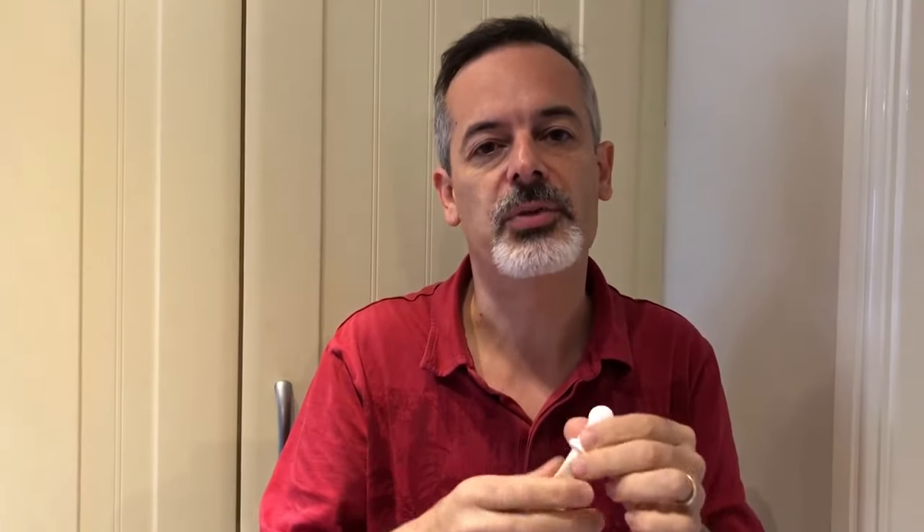Now that can be a bit difficult to do in some people, so you may want to blow up the balloon a few times with your mouth like a normal balloon, or even put a softer balloon.